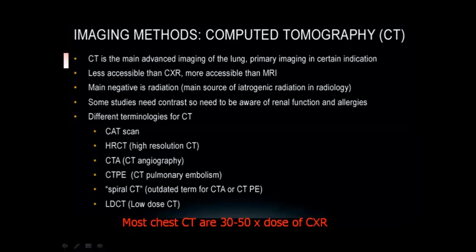Usually, a computed tomography study exposes the patient to X-ray irradiation in doses that are up to 50 times higher than doses used in conventional X-ray.